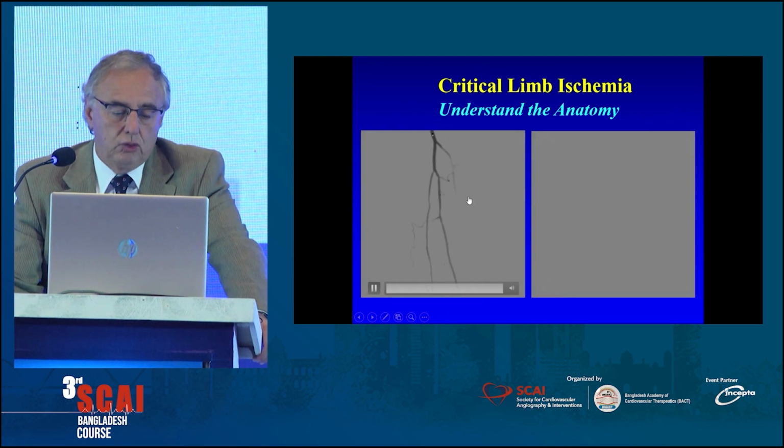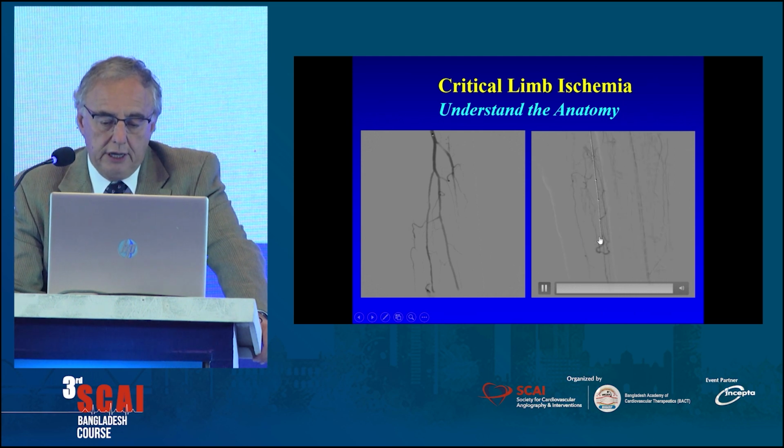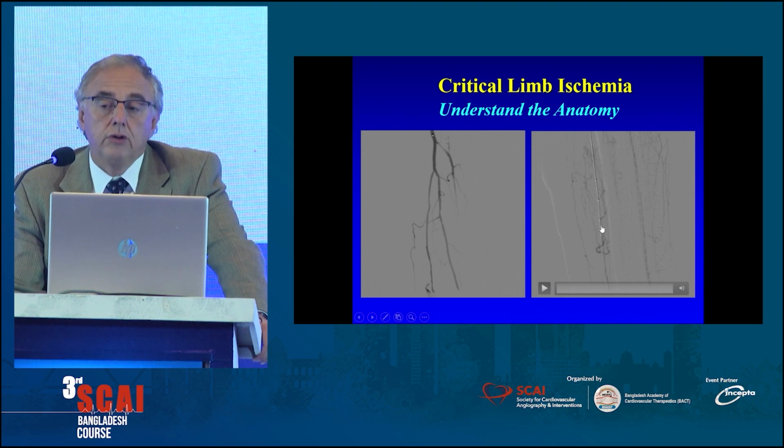So I tried to do an opening of that artery antegrade, and you see my microcatheter is here, and if you see the artery, I am completely out. So I tried to re-enter, and I couldn't re-enter.